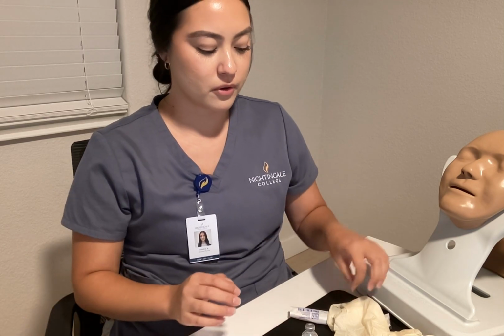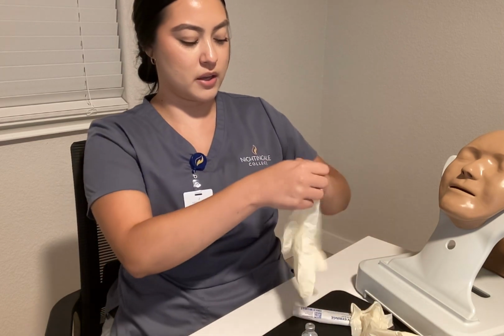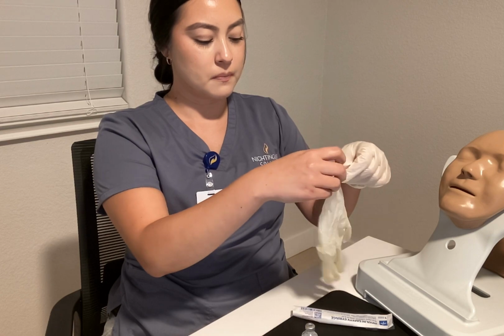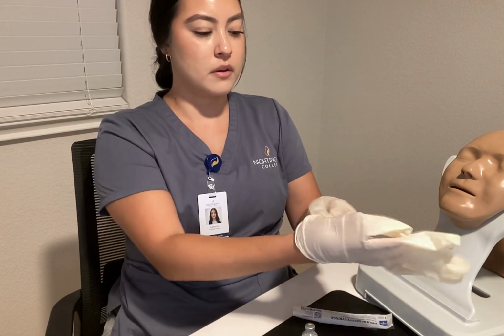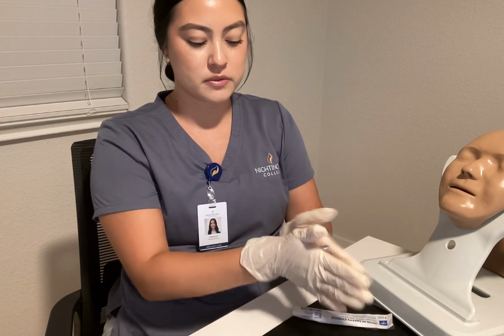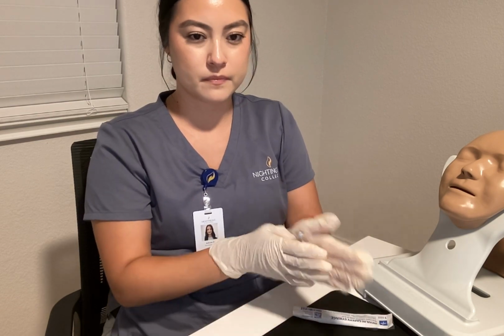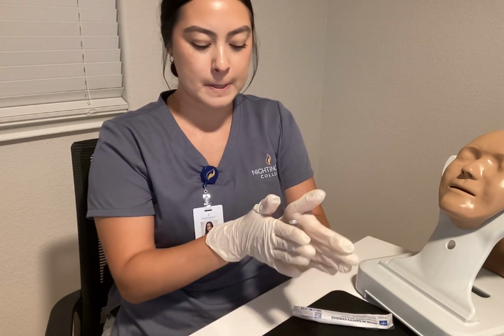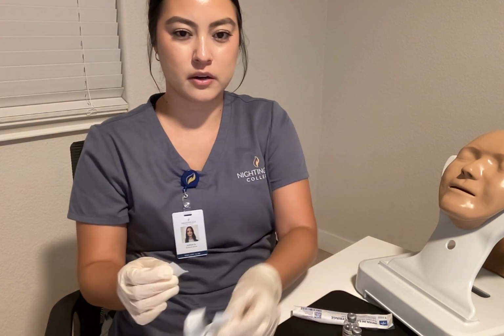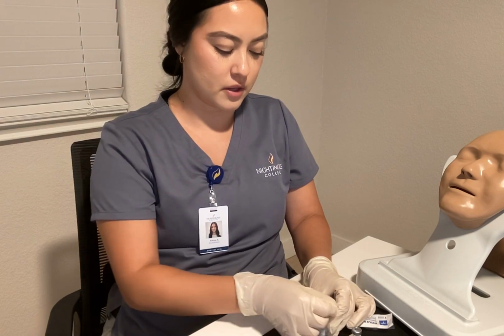So before we go ahead and get started, we're going to don gloves. And we're just going to roll our vials. After this, we're going to go ahead and clean our vials with the alcohol pad.